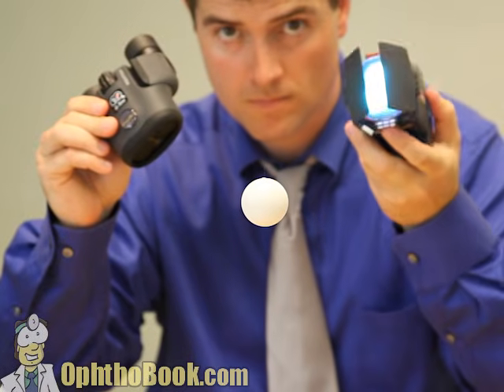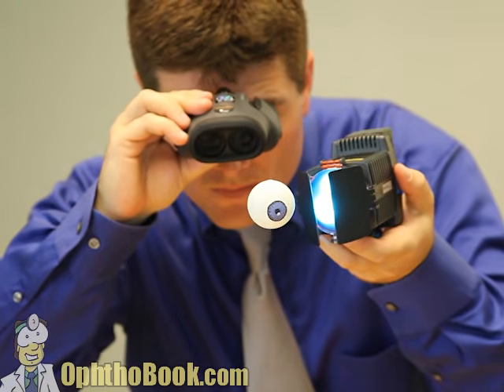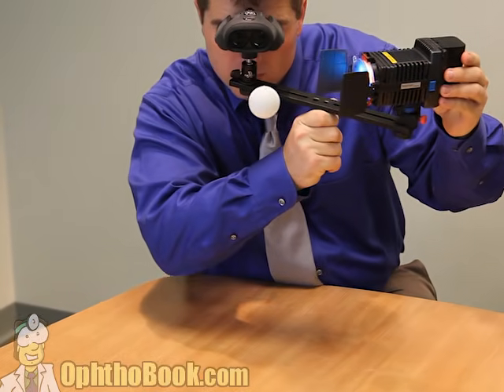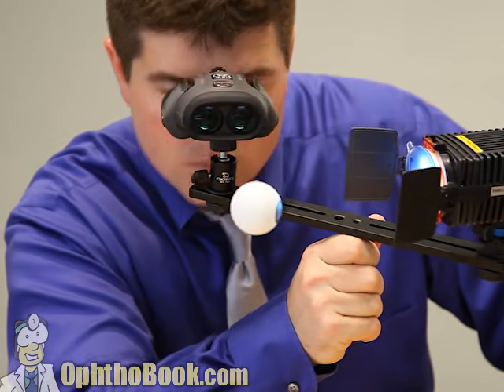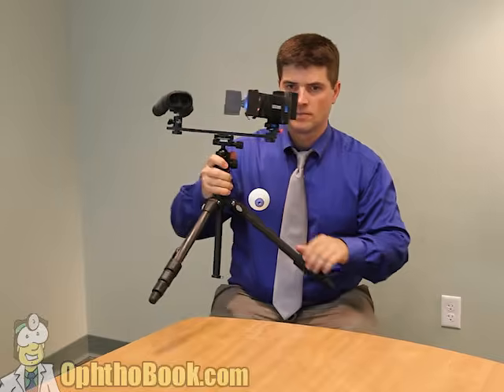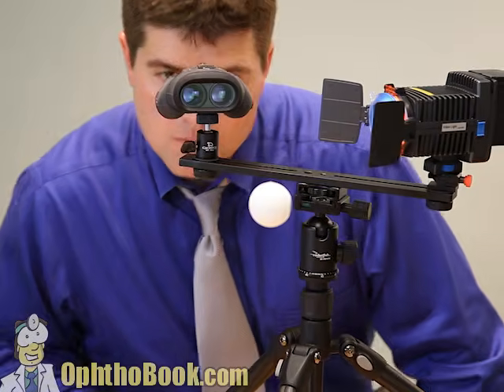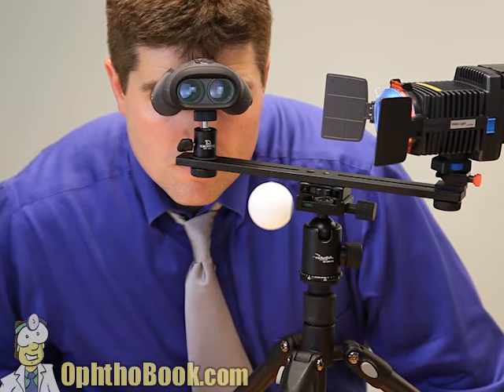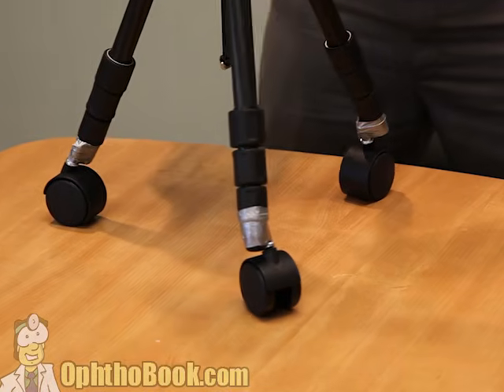So we have a perfect microscope, a perfect light source, but how do we use these things in synchrony with each other? Because it's very hard to focus them independently. Well, you can put them on a bar so that they're in focus at the same point at all times, and this works great, but it's hard to stabilize this and hold it. So let's put it on a tripod. This is much better, nice, stable, very little movement, but we can probably improve our design a little bit more by adding some type of wheels to the bottom of our tripod.